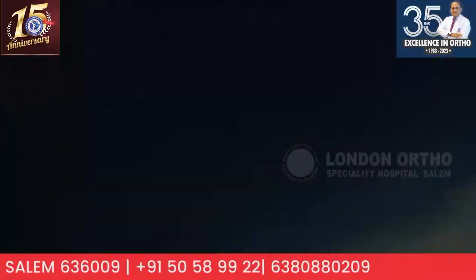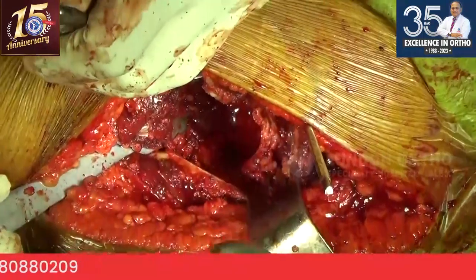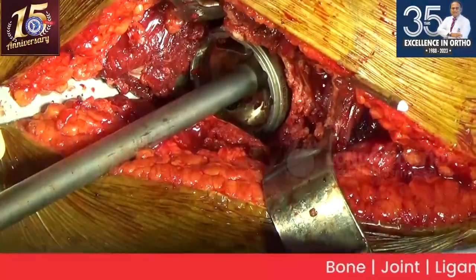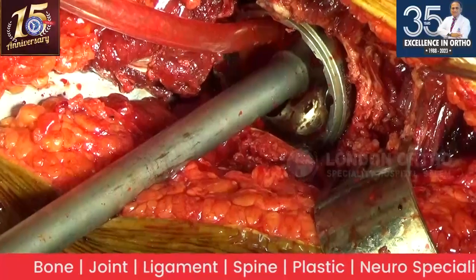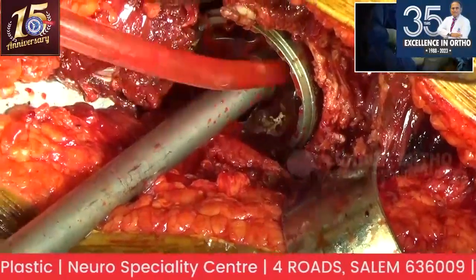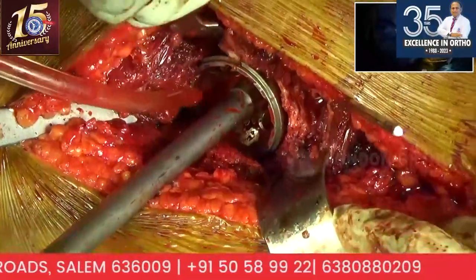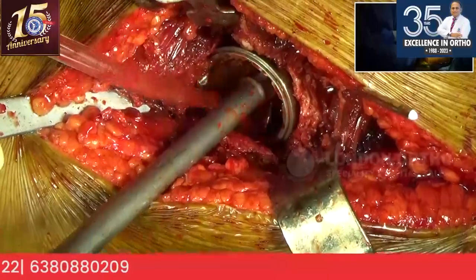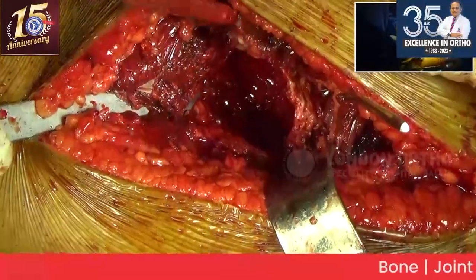Suction, please. 40. See, I reamed up to 46. This is the 48. Peripheral fit is not good, and centrally also no. I'm going to ream 46 again to deepen it a bit more.